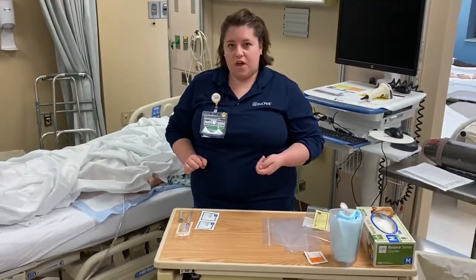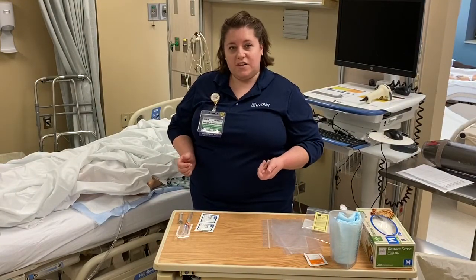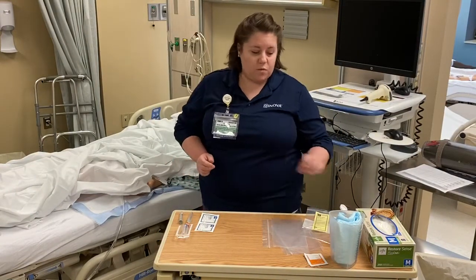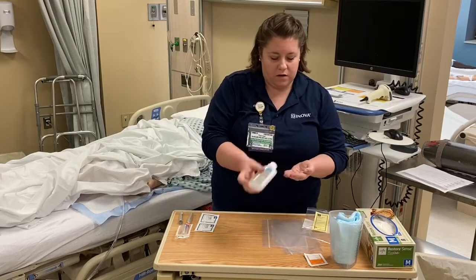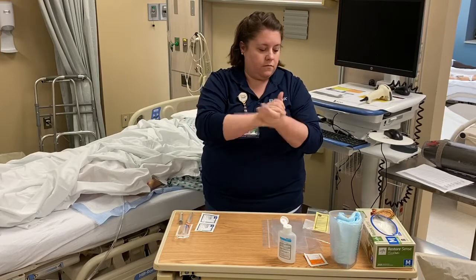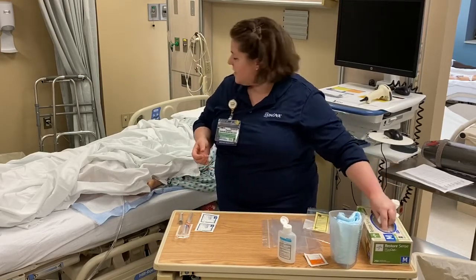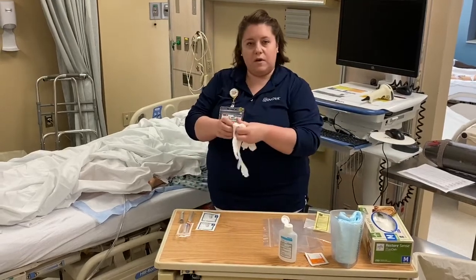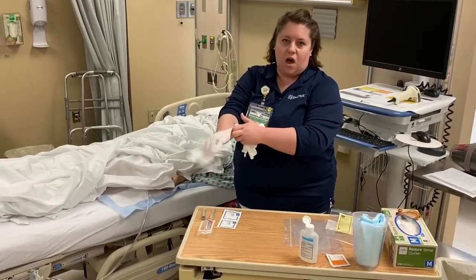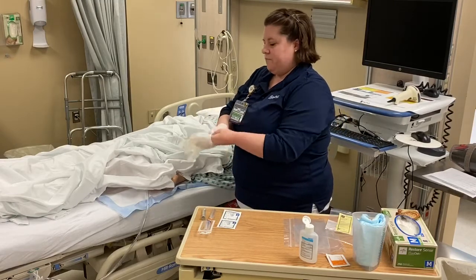All right, so if I look at the time, it's been about 10 minutes, so I'm ready to do my collection. So I'm going to wash my hands and put my gloves back on. Miss Muhammad, how are you doing? I'm getting ready to do your collection. I want to make sure in the 10 minutes that I'm also talking to my patient, putting them at ease and making sure that they're okay.